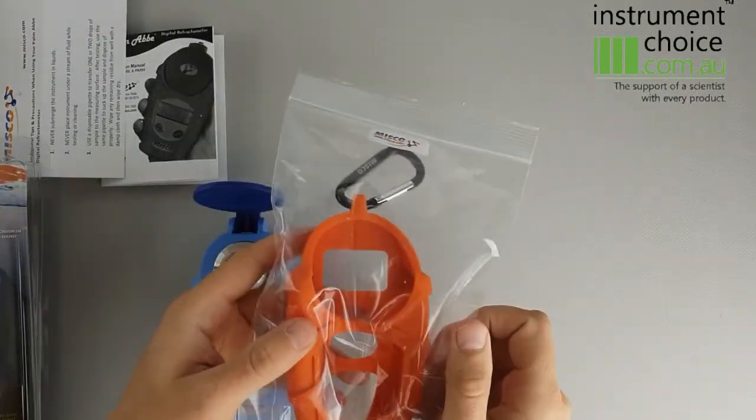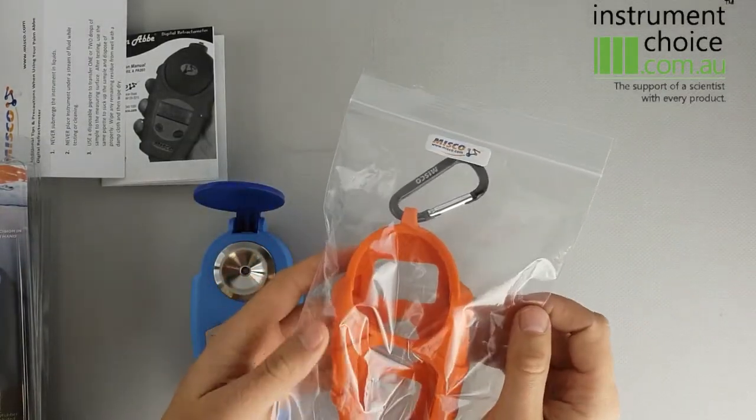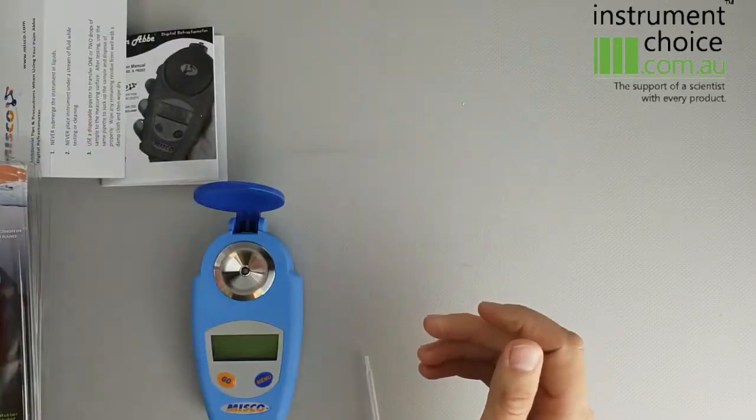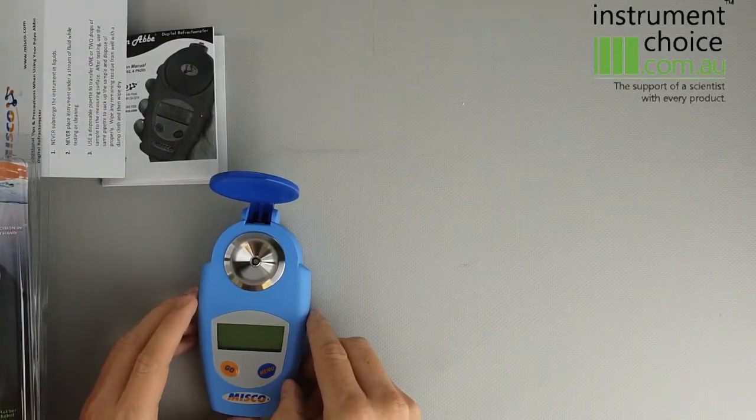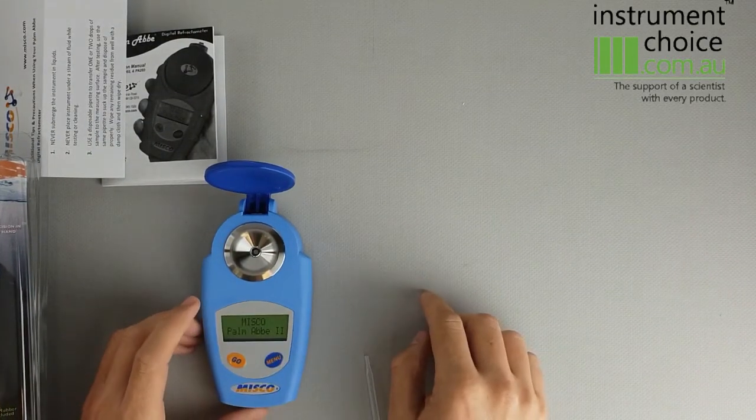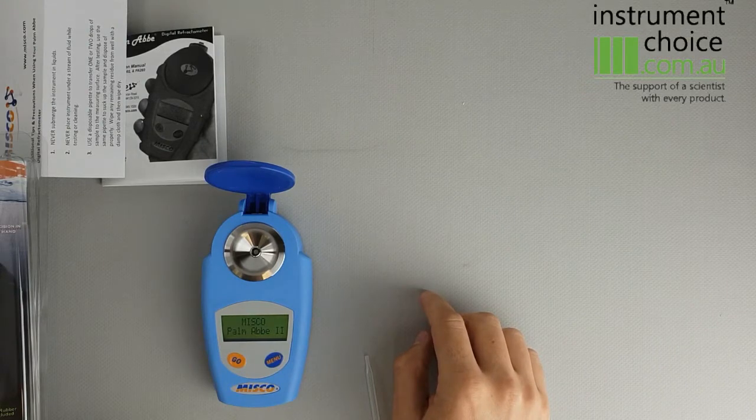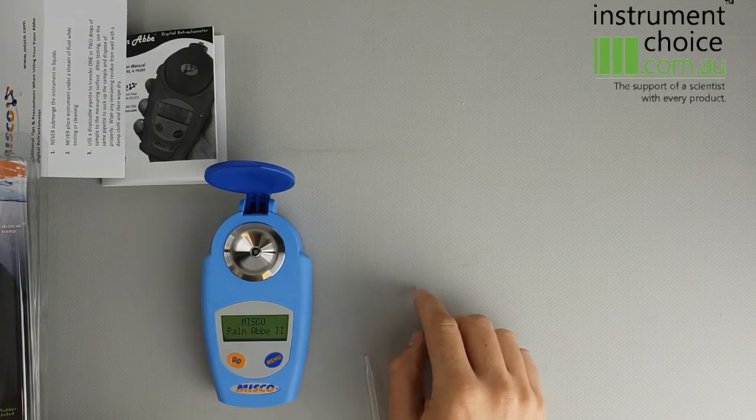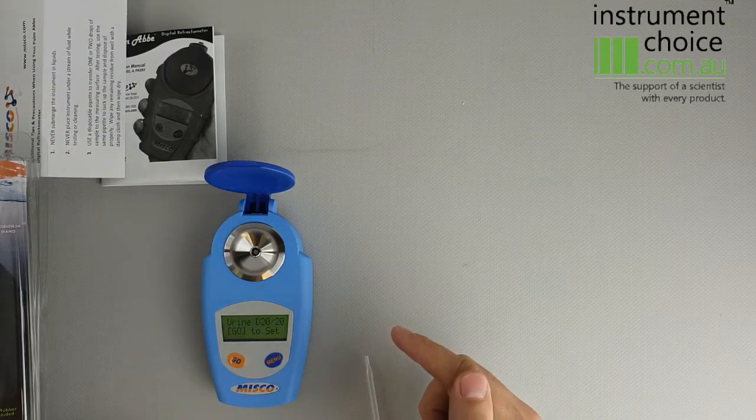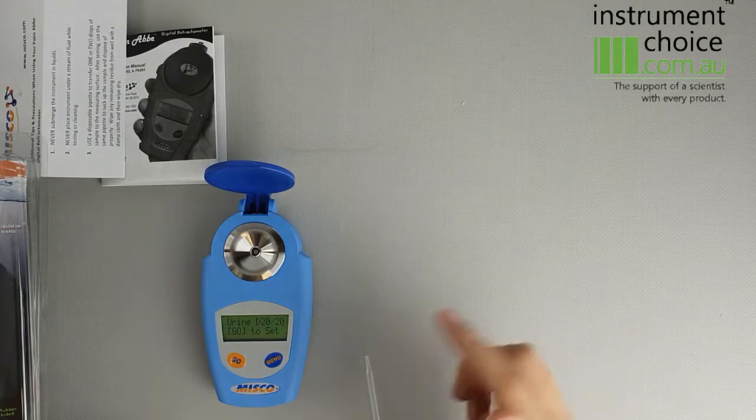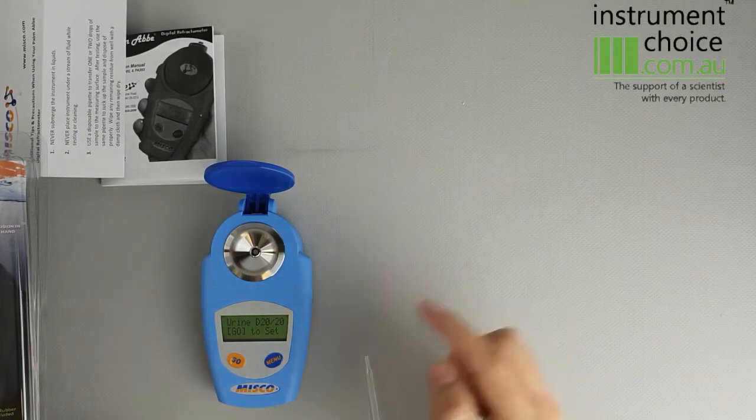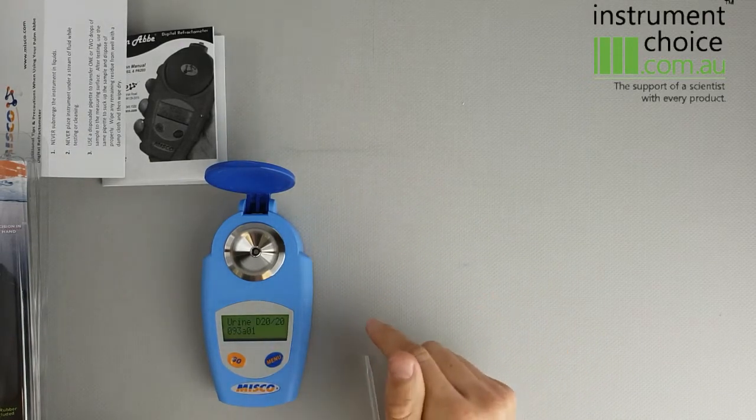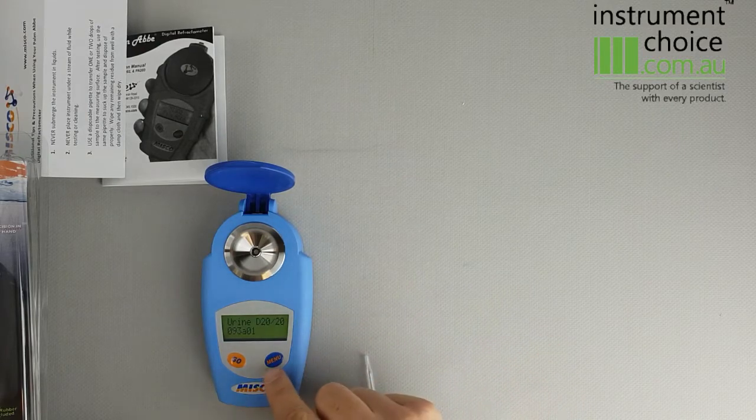You can also get this ruggedized case for it to give it a bit more protection. It's a fairly straightforward meter to operate, so essentially GO powers the meter on and the menu function is used to scroll through the menu functions. This one's already set up for urine, so basically once it's calibrated using distilled water, you're ready to go.